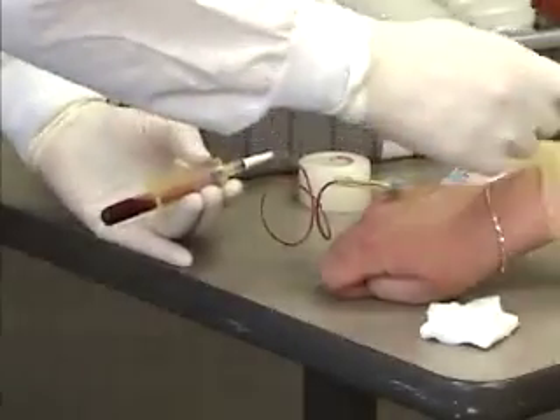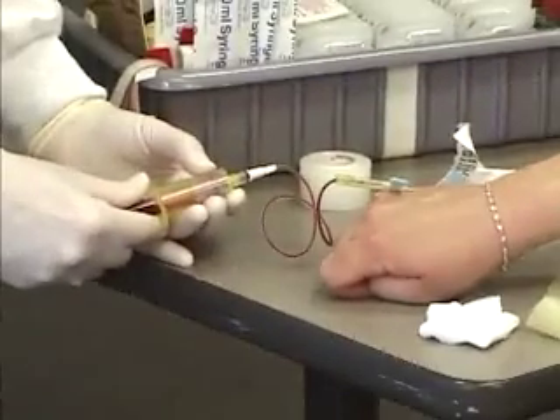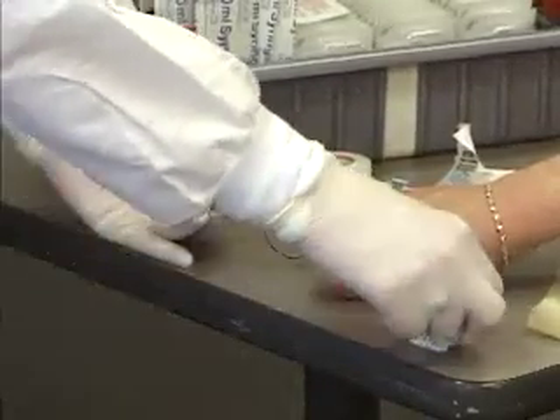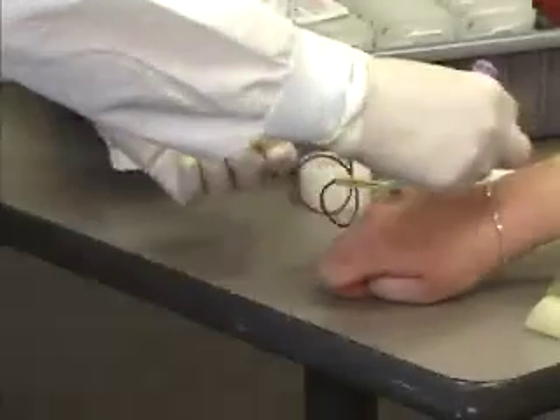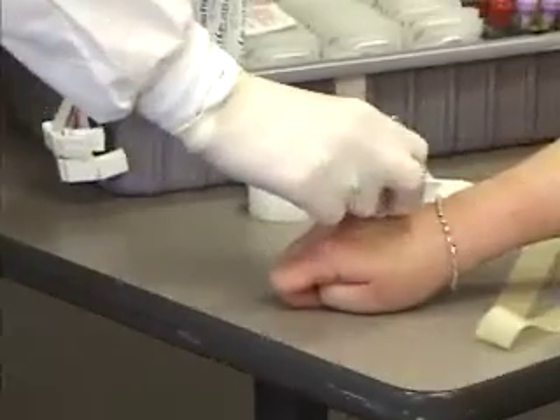I'm going to release my tourniquet. I'm going to remove my tube. If I kept the tube on when I took the needle out, it can actually cause the patient to have a bruise because the vacuum would still be present. And I'm going to withdraw the needle swiftly and apply pressure.